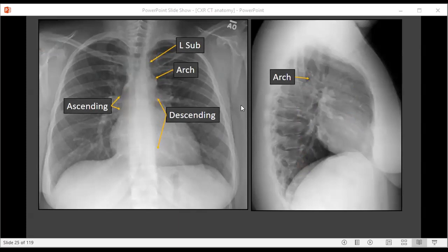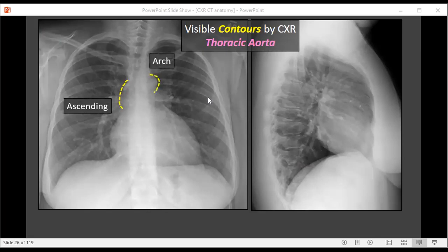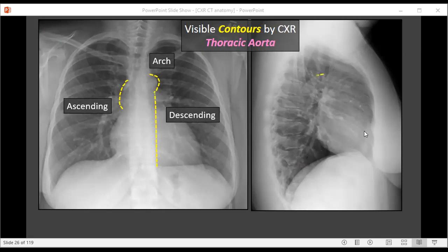The question becomes which portions of the aorta can we actually see radiographically, and these are defined by the contours it creates by interfacing with the lung. The first contour we can see just above the heart is the ascending aorta. The next contour is this circular-shaped structure — that's going to be the aortic arch. After the aortic arch adjacent to the spine, we can vaguely make out a line — this is the descending thoracic aorta, a posterior structure. On the lateral view, these are fairly hard to see; really the only line visible represents the aortic arch and proximal portions of the descending thoracic aorta.